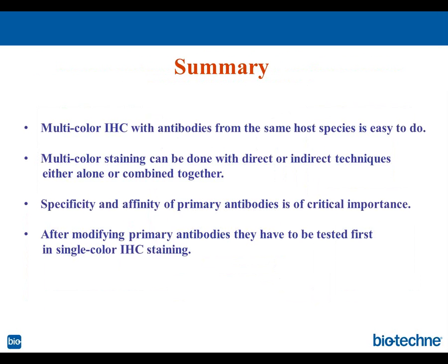Another way to do retrieval would be to reduce the temperature, because it goes into either a vegetable steamer or the special so-called decloaking device, where the temperature is very high. It's almost 98 degrees C, almost close to boiling. You may want to try lower temperatures, go to 70 degrees and see how this will work. These are the only suggestions.